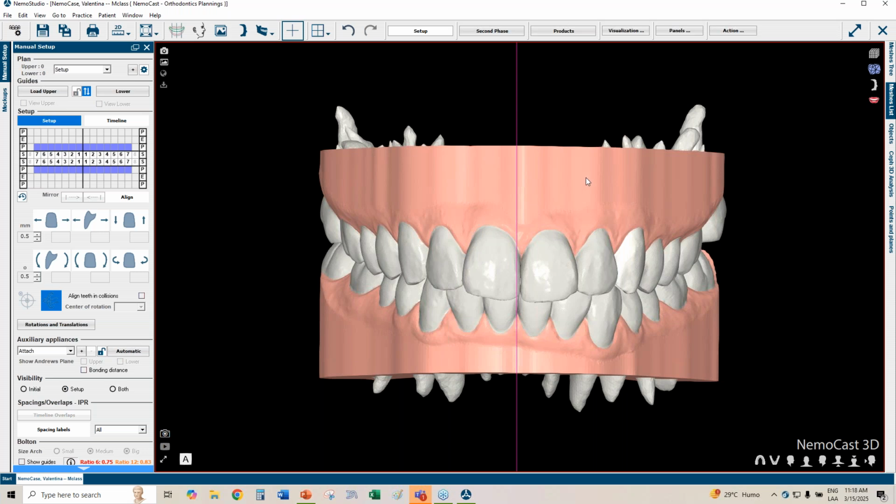Okay, yeah. Well, we'll get to that a little bit later, so don't worry about it. I will show you where that is. I will get that. But since we have a more or less tight schedule, because we're going to do a full setup together, don't worry, I'll show it to you. In case I tend to forget, I always give some room for questions at the end, and if I forget that or if it's not clear, please write it to me again.